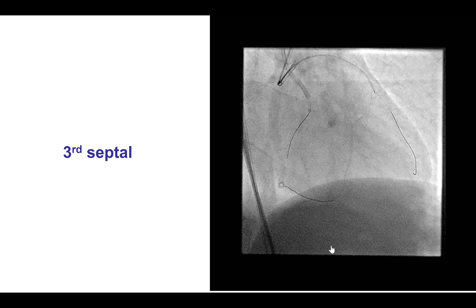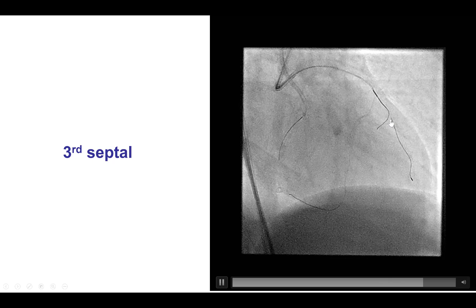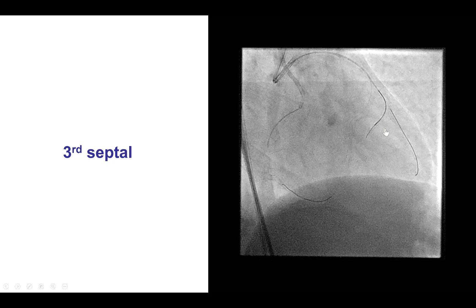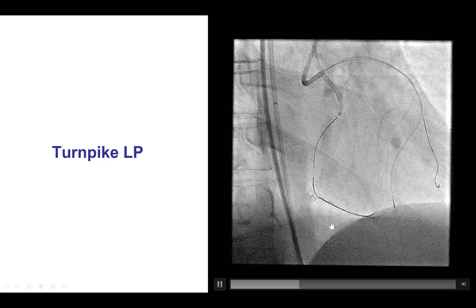We used a workhorse guide wire to enter that distal septal branch, and a Turnpike LP microcatheter was advanced over this wire. Then with a SUO-03 guide wire, very easily this time, it crossed into the right posterior descending artery. And the best part was that the Turnpike LP microcatheter also very easily crossed through the septal all the way to the posterior descending artery.